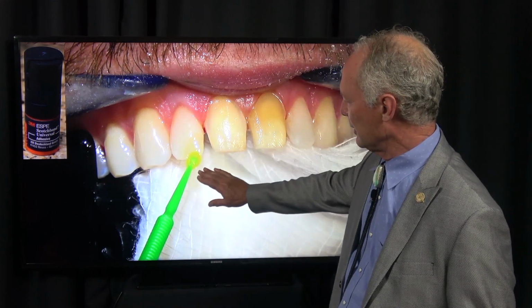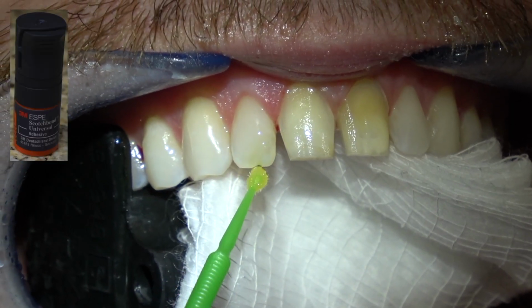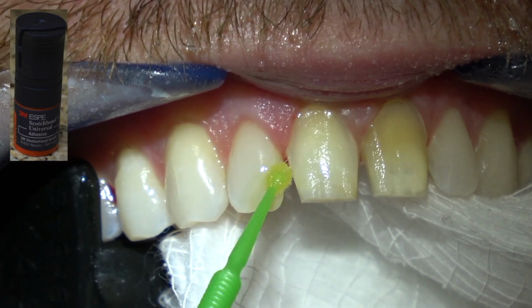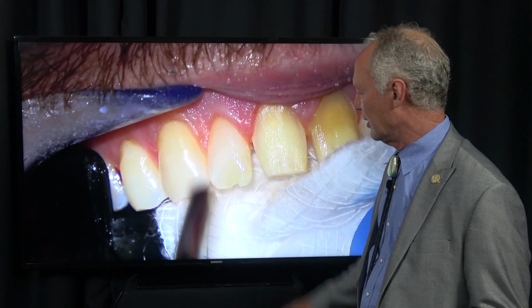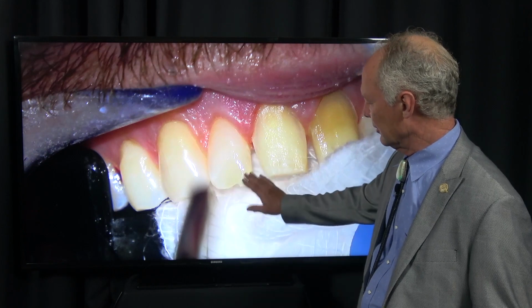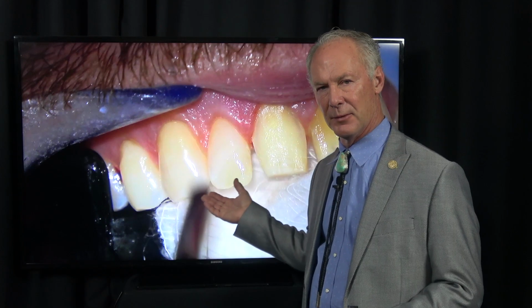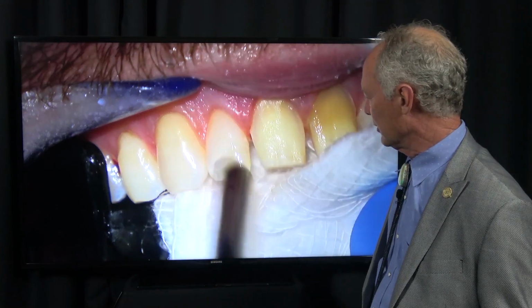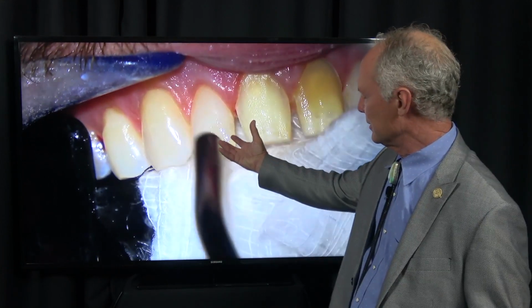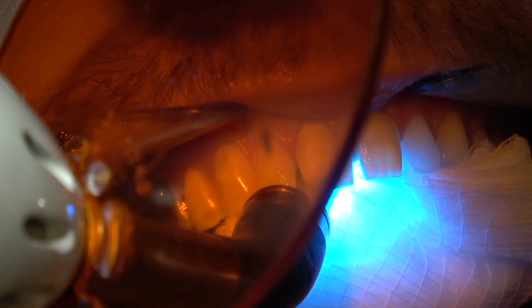Then I'm wiping the primer adhesive on the prepared area. And then this is very important. Once you do that, place a copious amount on the preparation, then blow the excess off onto a 2x2. Blow it until nothing wiggles. There's acetone carrier in the primer adhesive, and if you leave the acetone carrier in the primer adhesive, it can affect the bond strength. So blow it all off until nothing wiggles onto a 2x2, and place a 2x2 around the tooth so you don't blow it all onto the tissue and the adjacent teeth.